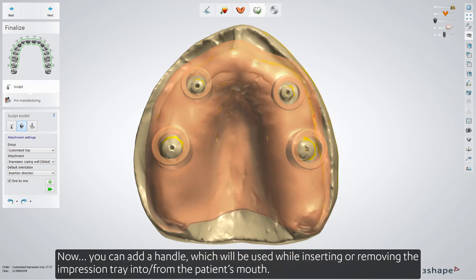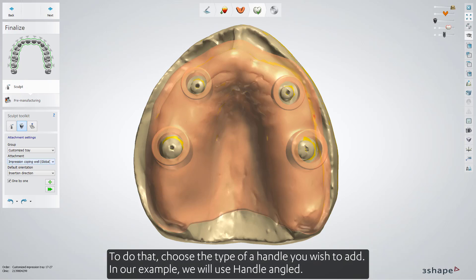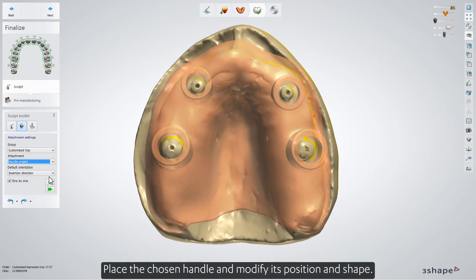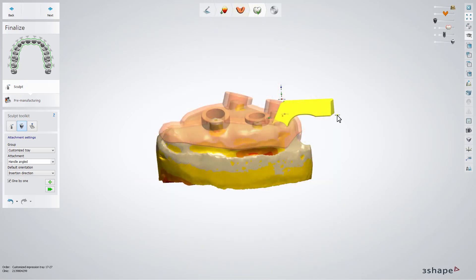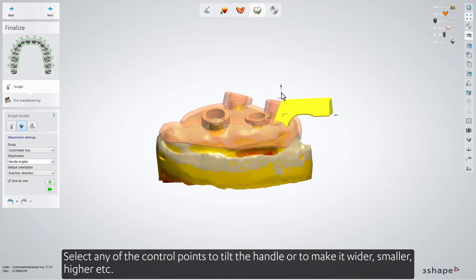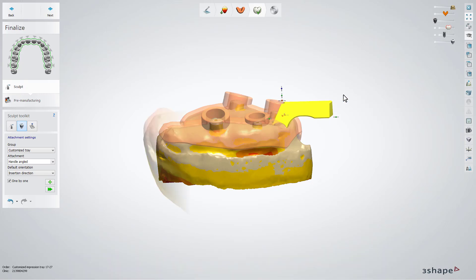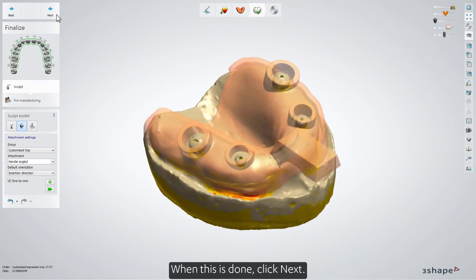Now you can add a handle, which will be used while inserting or removing the impression tray into or from the patient's mouth. To do that, choose the type of handle you wish to add. In our example, we will use Handle Angled. Place the chosen handle and modify its position and shape. Select any of the control points to tilt the handle or to make it wider, smaller, higher, etc. When this is done, click Next.